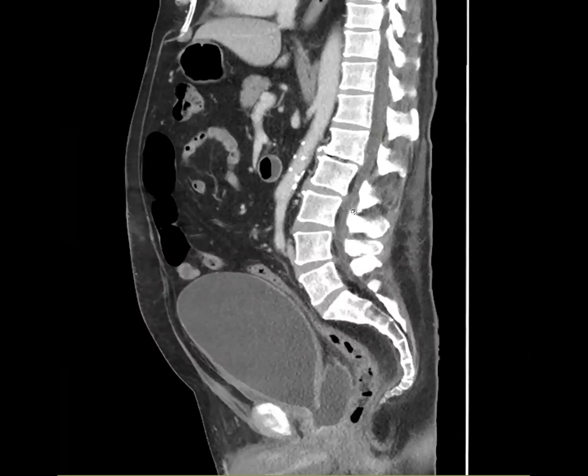You've got a good memory for that. I remember that case. I had one similar too, and you said yours they treated with a Foley and then it was still contained, and they decided to just treat it as an extension of the bladder. In this case, because it's causing the hydro, I wonder if there's also a stricture below it that caused it to outpouch like this and cause the hydro, because the bladder looks so full. Like, why are we not voiding properly here?